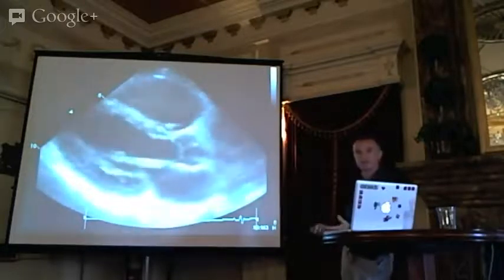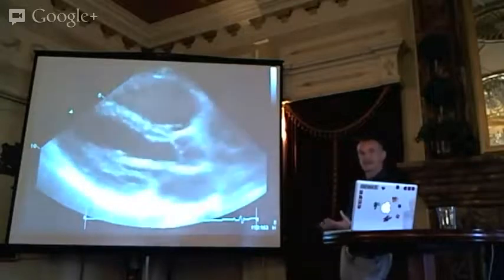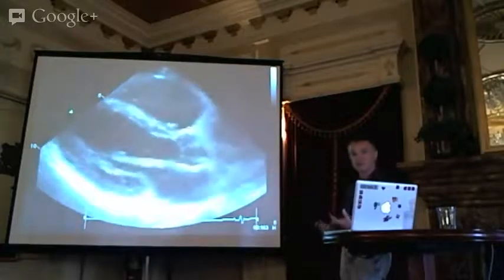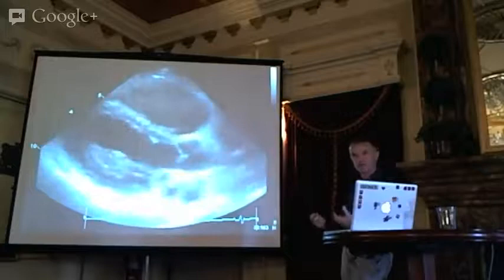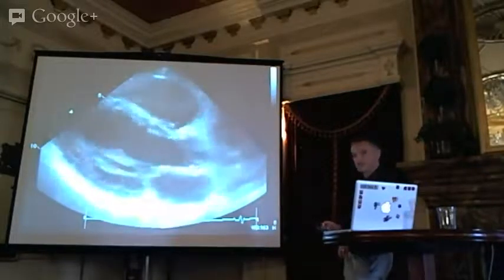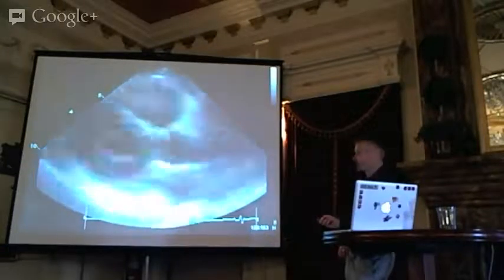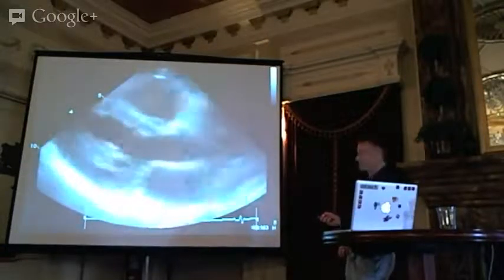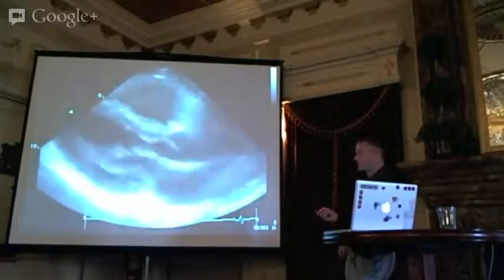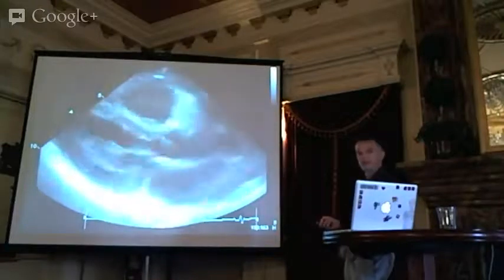We don't need a percent, we don't need a number, we need a global visual assessment. See that this is likely to be a pump problem causing this patient's hypotension and shock, a terrible situation. So is it contracting evenly all the way around? Is the chamber size getting smaller in systole compared to diastole? And also look at this anterior mitral valve leaflet. It should get fairly close to the septum as it flips forward. If it doesn't go anywhere near the septum, that can be an indirect marker of pump function.